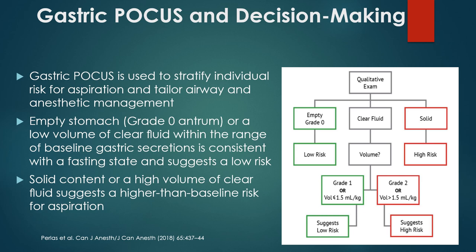Again, there is operator error. You probably need to be following the ASA guidelines. I understand there's a lot of discussion about which guideline to follow, whether it's ultrasound guidelines or whether it's a time type thing versus a type of volume. That's something that's up to the individual provider. But to be honest, I'm going to go the safest route. And so are you, I'm sure.